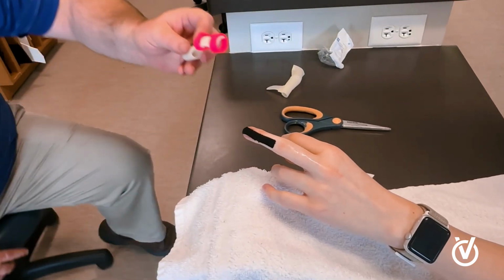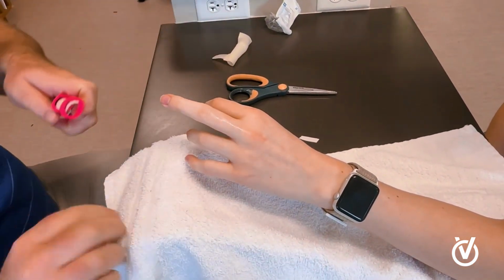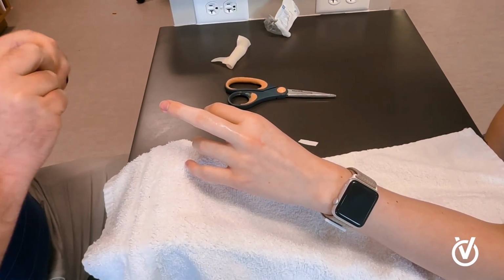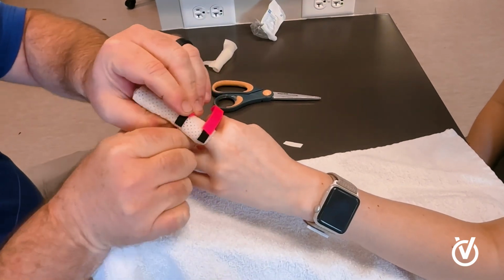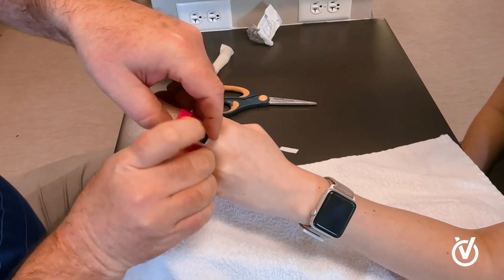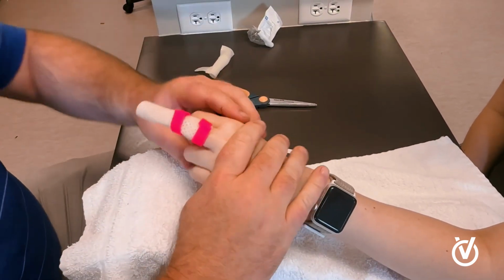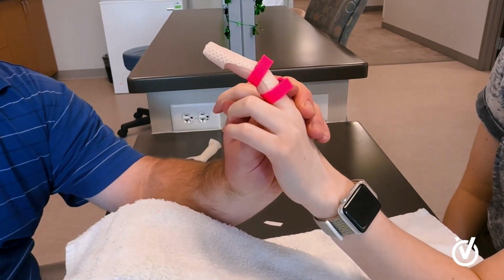Here's one that I've already finished. Of course, we remove the kinesio tape, apply the splint, one strap right at the PIP, now on there. And you'll see it holds her PIP in slight flexion with the DIP in extension.